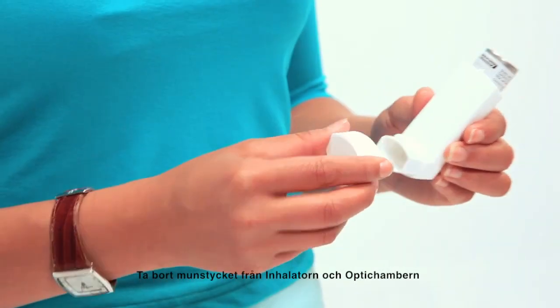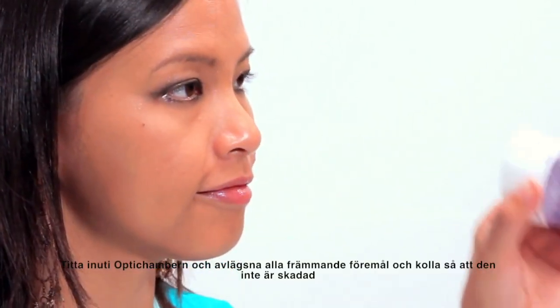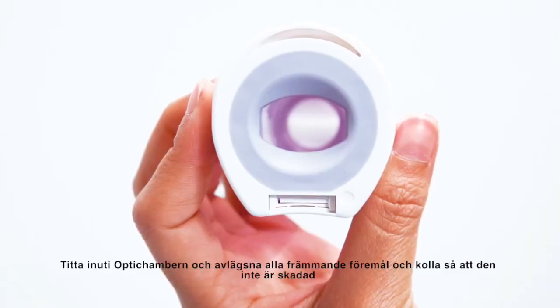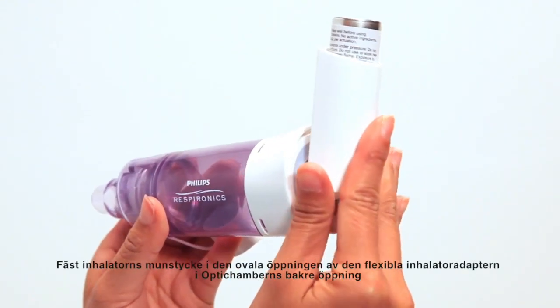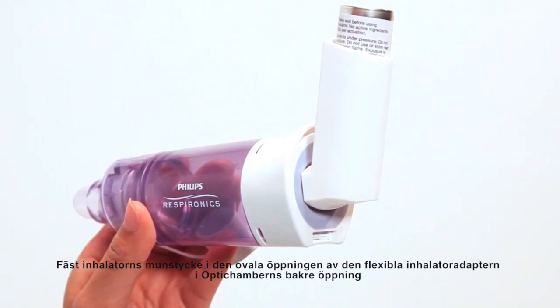Remove the mouthpiece caps from the diamond and the MDI. Look inside the diamond and remove any object that doesn't belong there and check for damage. Insert the MDI into the oval opening of the flexible MDI adapter at the end of the diamond.